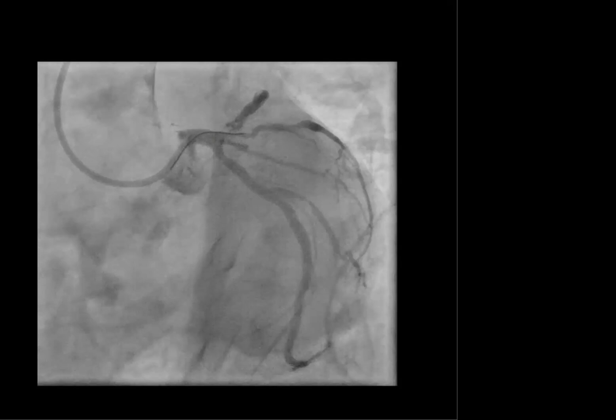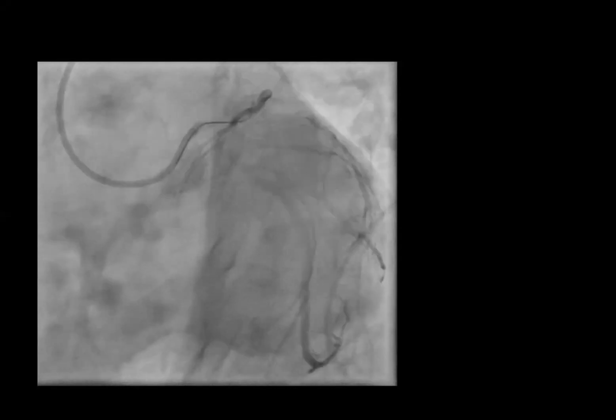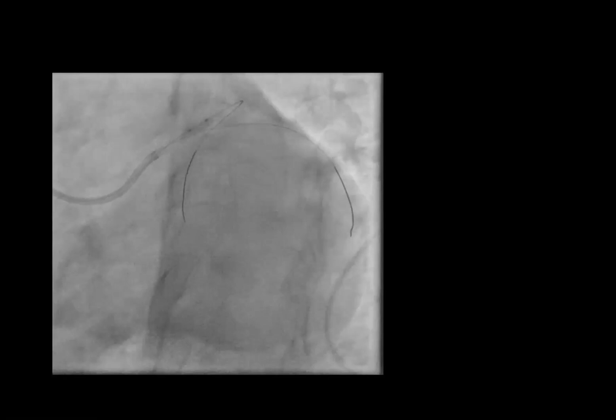After that, once crossing was achieved, we crossed with two wires — one wire into the diagonal and the other wire into the proximal LAD. The next thing was dilatation of that lesion. Since the patient was having hypotension and was in shock, the first thing was to attain flow in the coronaries, which we were successful in.